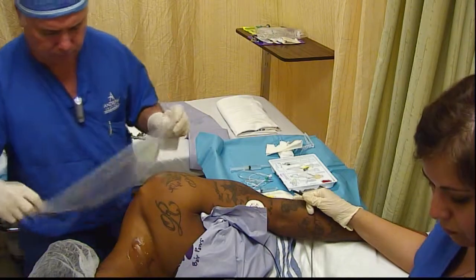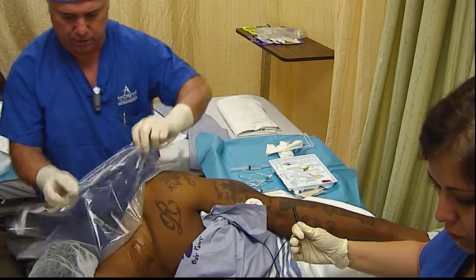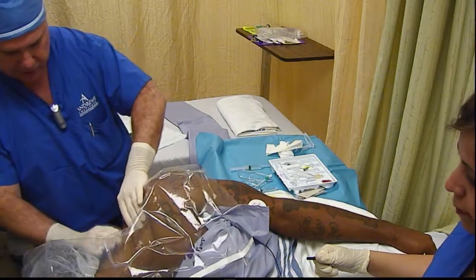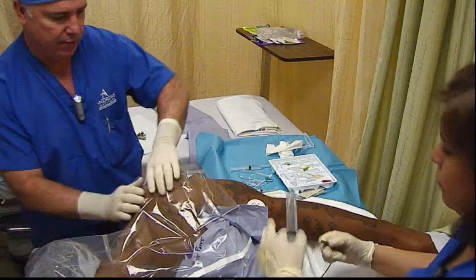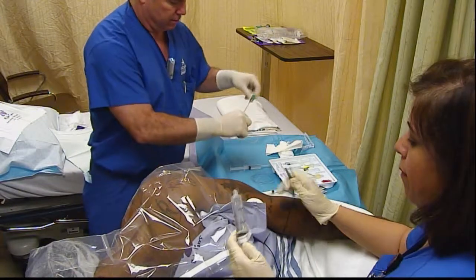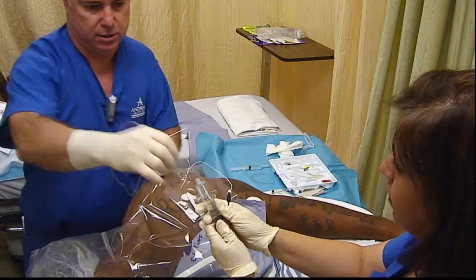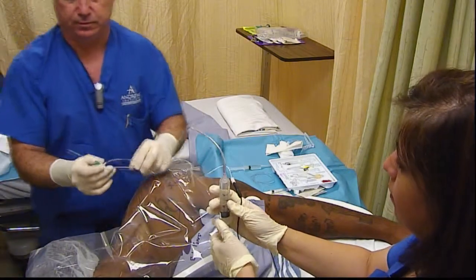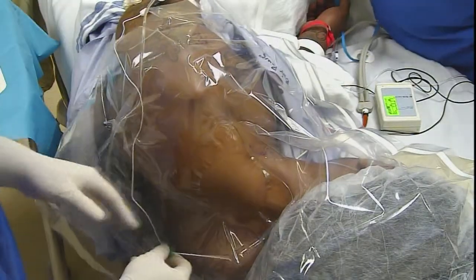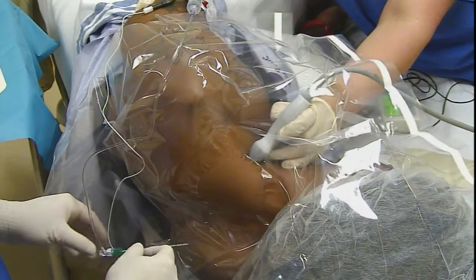We're going to put our sterile drape on. Now we've got plenty of room back here posteriorly to work. We've got a significant amount of hair to work around but we can do it — we did it last time. We have them pull the arm down to pull the shoulder out of our way to give us more room to work with. We're going to use a ContraPlex Tuohy needle, so we will stimulate to get a twitch usually up in the deltoid area or the pec. Always flush out your line because you don't want to inject air through that line and get that bright white splash in your ultrasound image. You can see our nurse comes in with our ultrasound probe.